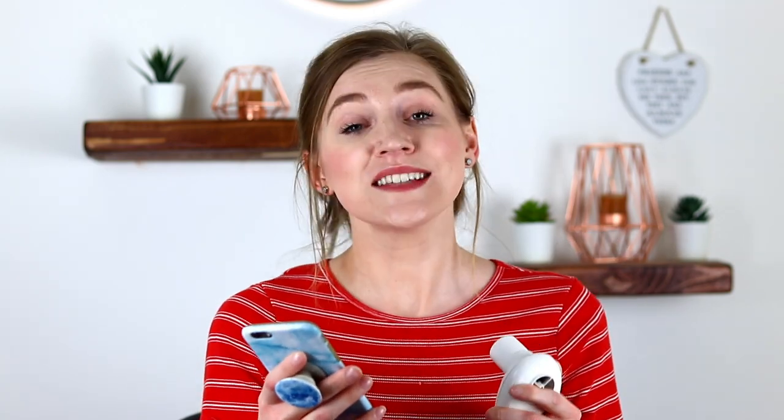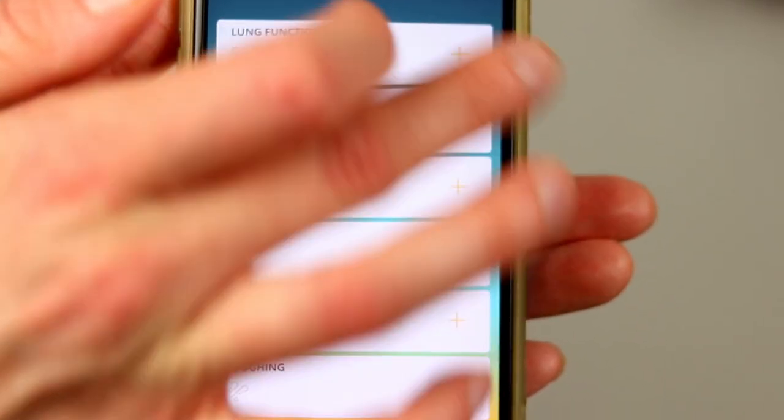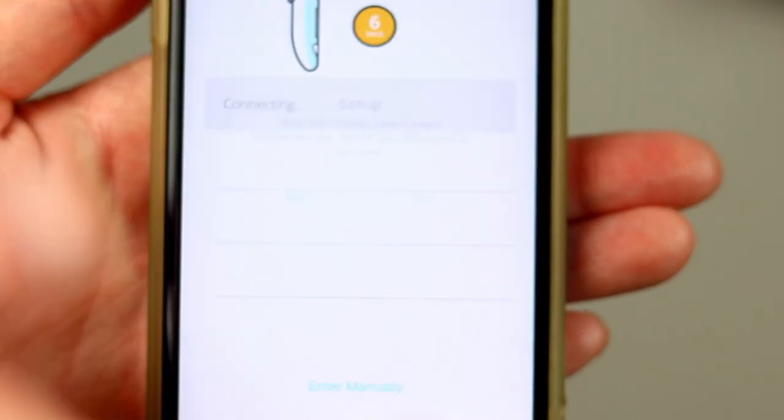This bit is easy. All you need to do is open the Breathe app, tap the plus button for the lung function, and the app will detect that you don't have a device set up yet, so it will guide you through doing this. Press yes to the setup prompt as well as yes to any Bluetooth pairing or location requests. Location is only used for Bluetooth devices and the app does not track your location.